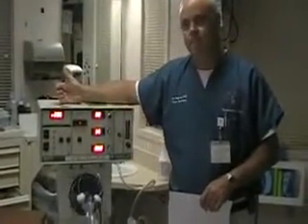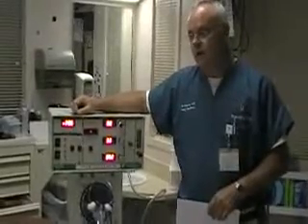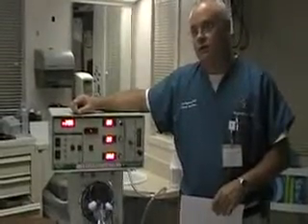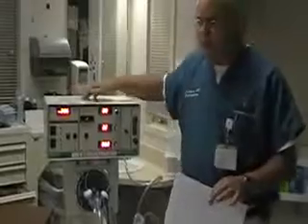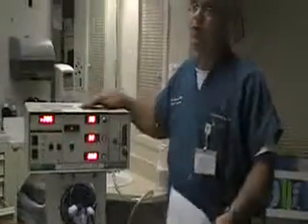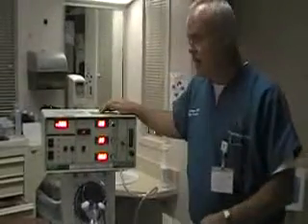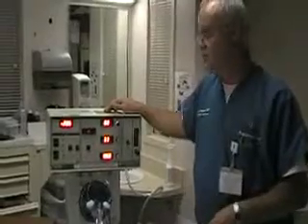Jim, can you go over compensating for a cuff leak? Compensating for an ET tube cuff leak? Yeah. One of the things that Scott is talking about, we can have an ET tube cuff leak, and sometimes we want that. Sometimes we'll actually let some of the air out of the cuff. That is one of the strategies that we can use if someone's retaining CO2.